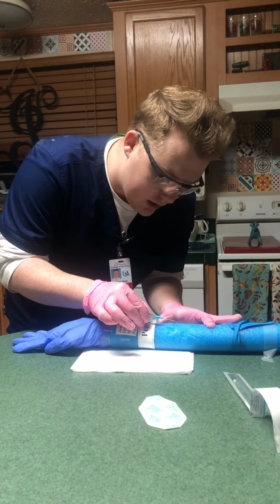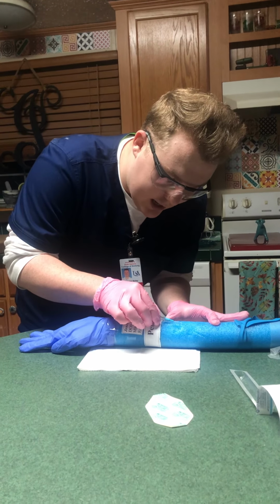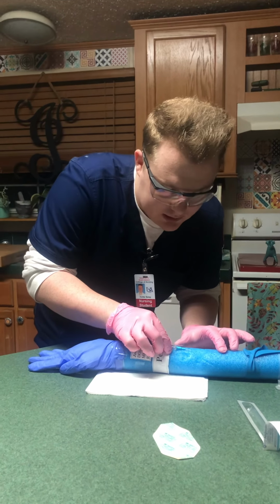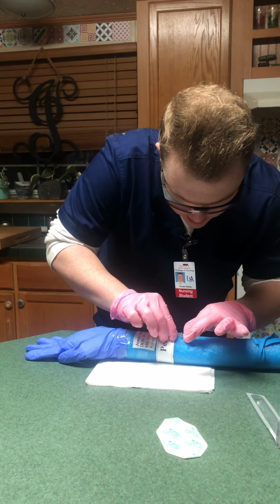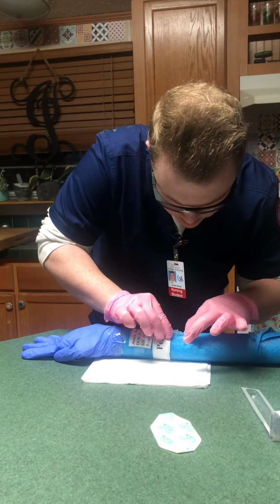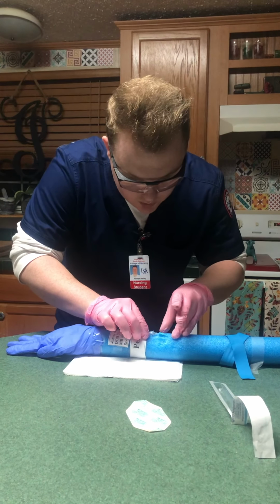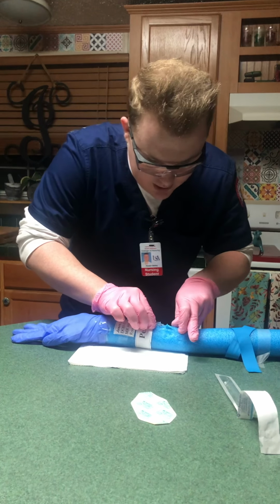Mr. Jones, it's going to be a quick stick, okay? 10 to 30 degrees. Okay, and I see blood, so I'm going to advance another 1/4 of an inch after I lower my needle. And so now that I see blood, what I'm going to do is take my left hand and move the catheter up, but not the needle. So I'm advancing the catheter. And I am going to pop the tourniquet, and I'm going to hold pressure 2 inches above, right here.